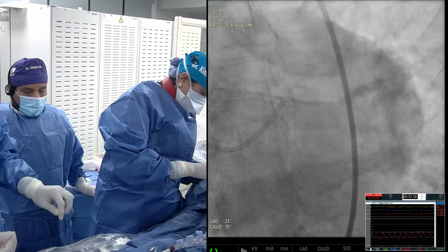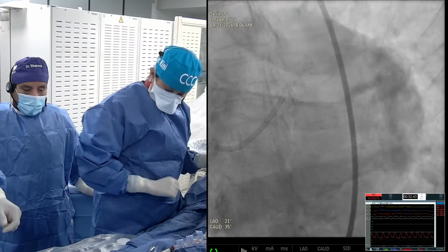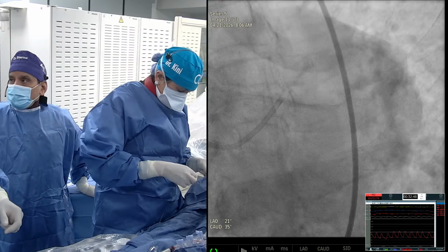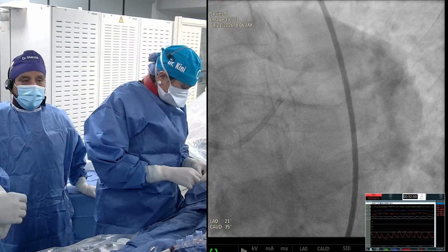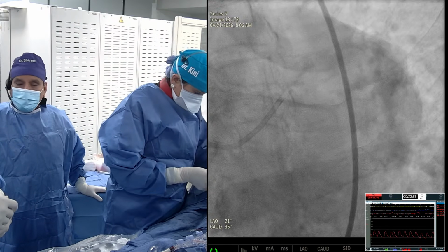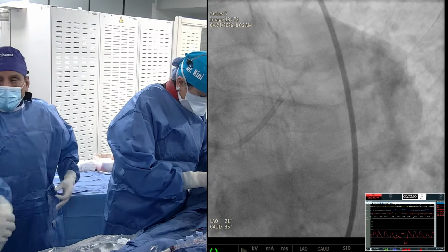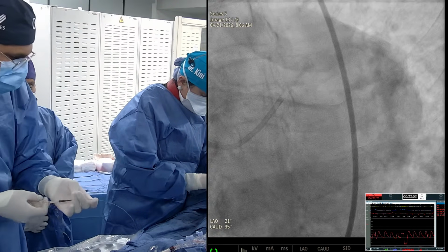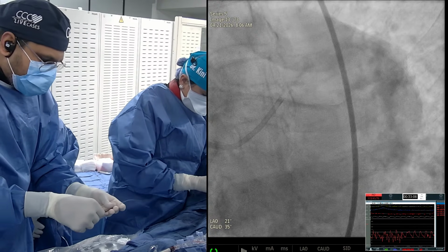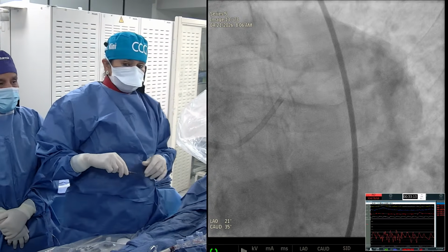Okay, so that's appropriate. So clearly now, the question of the Impella: I think we'll never know what to do with a normal ejection fraction and complex CAD, because none of the trials will answer that question. Even the current Impella MCS trials have an EF of 50%, it has gone up to 50, but the trial we are waiting for is PROTECT 4. Their EF was 30%. Originally they started with 40, then it became 30. So for near-normal ejection fraction and complex CAD, I don't think we'll have any trial ongoing, and we'll have an answer to that.